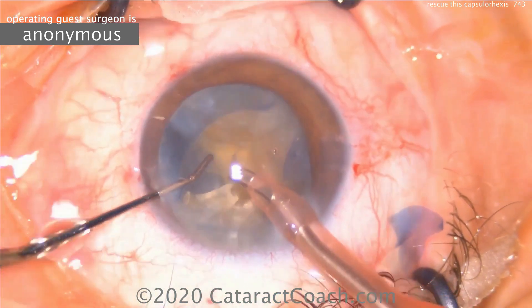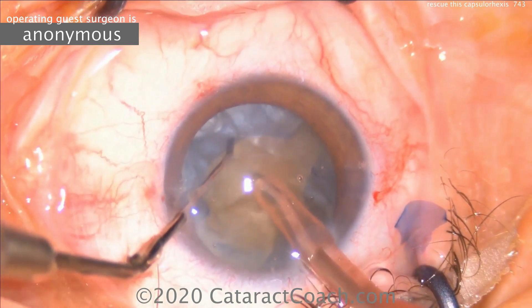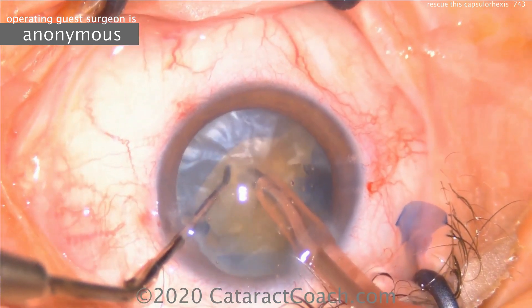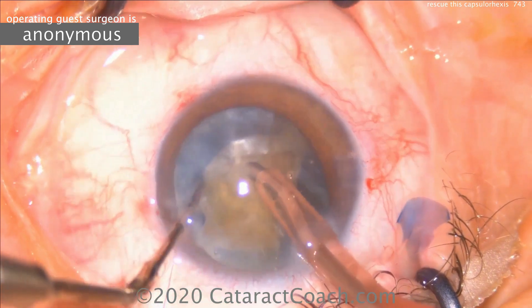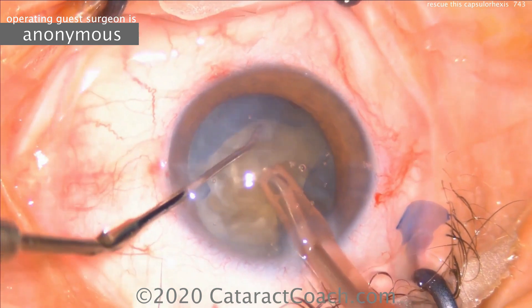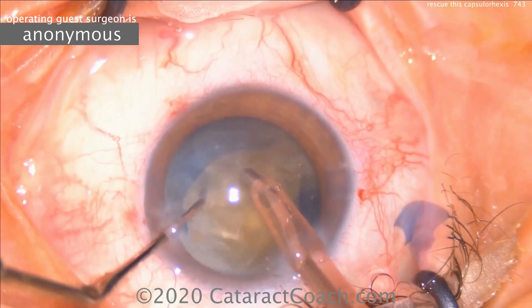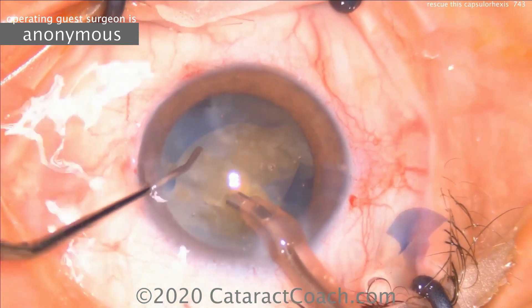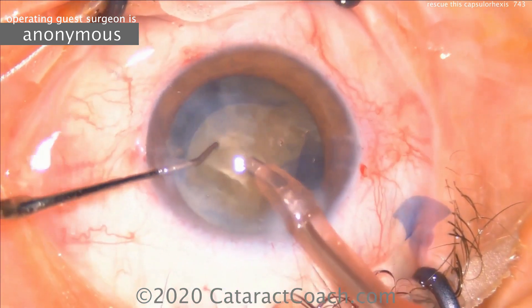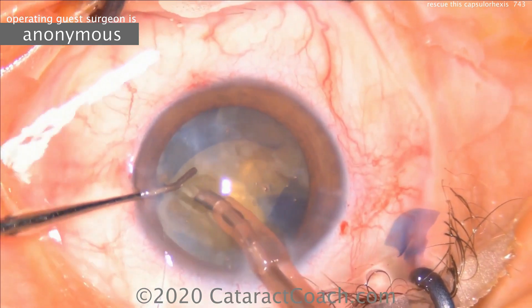The technique here is chopping the nucleus and not depressing it — he's lifting up the nucleus. The chopper goes around. Even though it's a very dense nucleus, he's able to chop it. Very careful to do limited movements. You don't want to put a lot of pressure on any part of the capsular bag. Take your time and remove this nucleus — this is the type of nucleus where you'll have to chop it many times: chop, chop, and more chop.